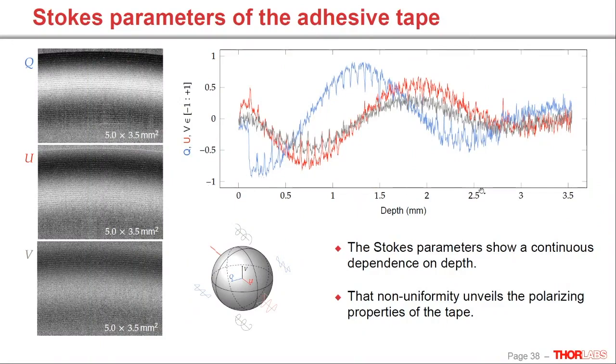And we also see that in this profile here, where we have this continuous dependency that gets a little smaller with depth, as expected, with some signal degradation because our intensity is not as great the further we penetrate into our sample. And we can already assume that our Scotch tape is birefringent, but having to look at three images at the same time to really see what's going on in our sample is not really handy.